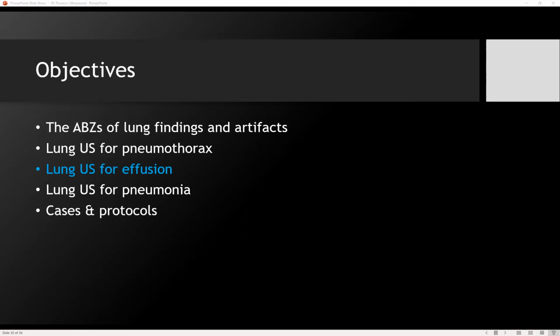Hey, so I think it's nice because if you're in that sort of situation after the fact and you ultrasound the lung, oftentimes it's a little confusing what you see. It's nice to get in the habit of, when you ultrasound the neck vessels before you start the procedure, taking a quick look at the lung on the same side and looking at how the sliding looks, to be able to compare pre and post procedure. If you don't see fantastic lung sliding pre-procedure and then the patient becomes hypotensive afterwards, you have something to compare it to. I love that so much.